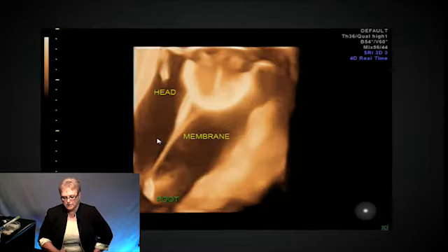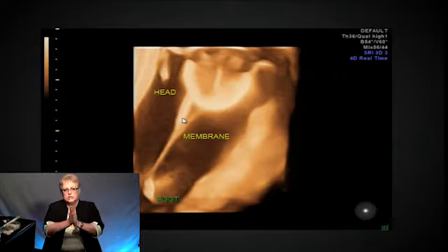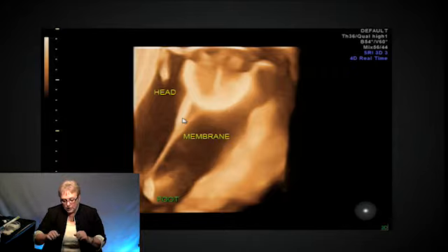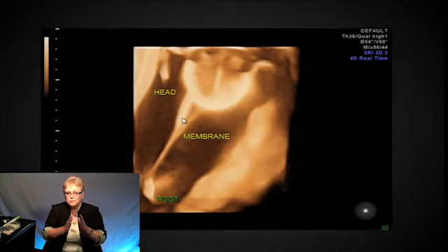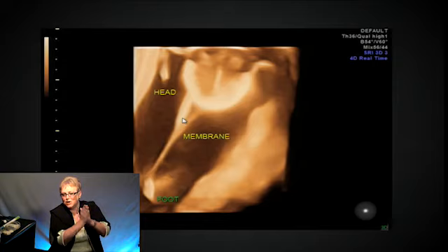So she proceeded on. You can see with the 3D. Look at that membrane. I mean, from the head, I mean, then the membrane's just stuck together. And sometimes they will get fooled because they think that, oh, look how thick that membrane is, so it's got to be dichorionic. Well, you can't just look at the membrane, because what happens is you can have 2 parts of the membranes together, and now it looks thicker, and what it is is 2 parts of the membrane together.